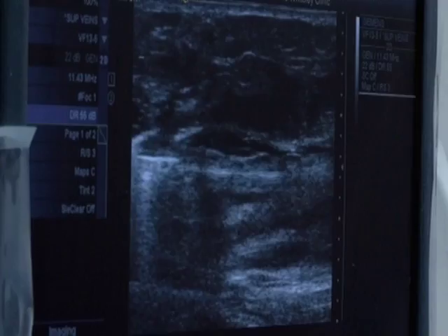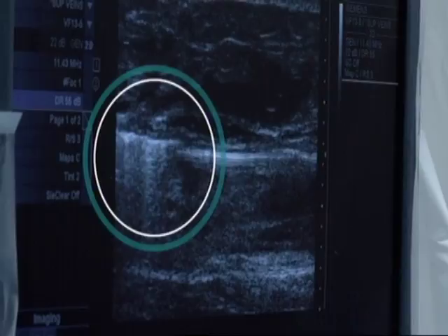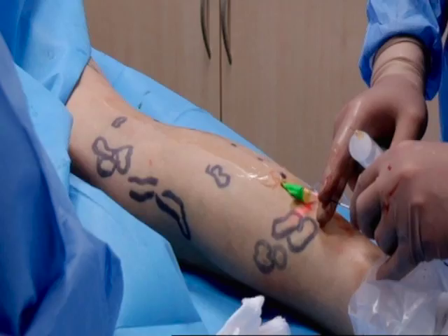How's that feel? Fine. On the ultrasound, we can see little bubbles showing that we're getting a nice burning of the vein.